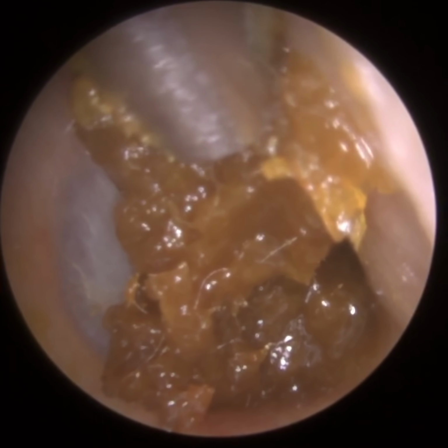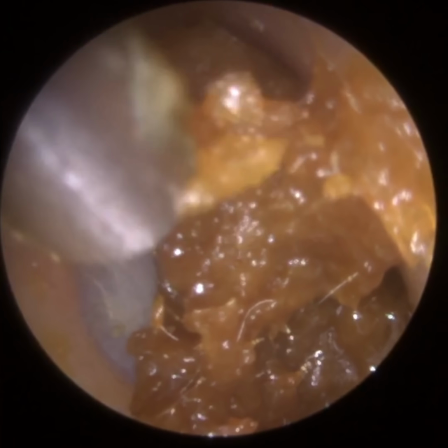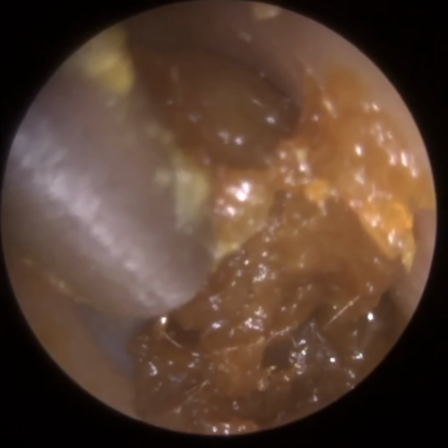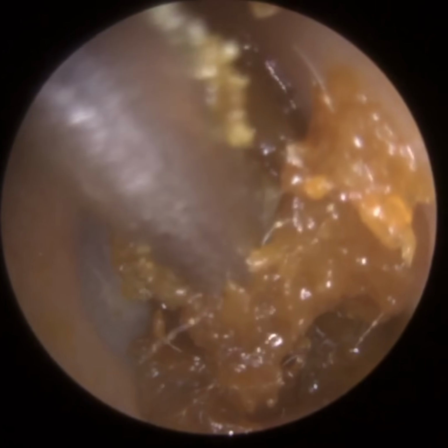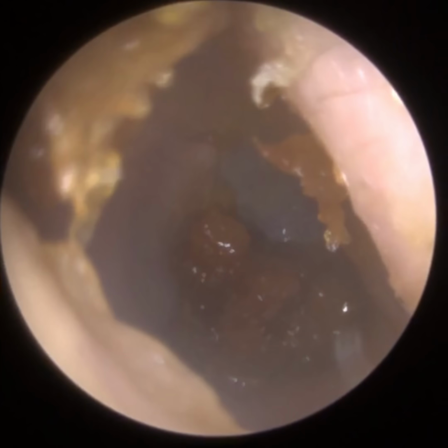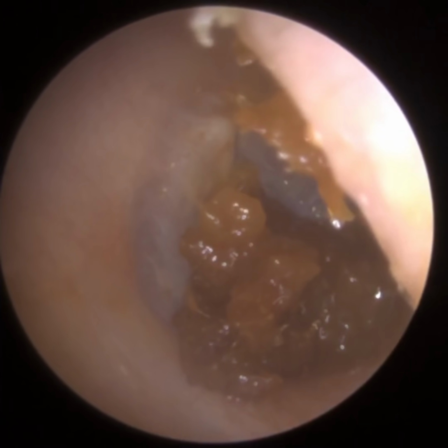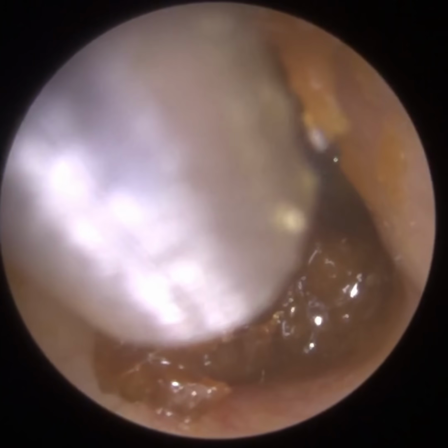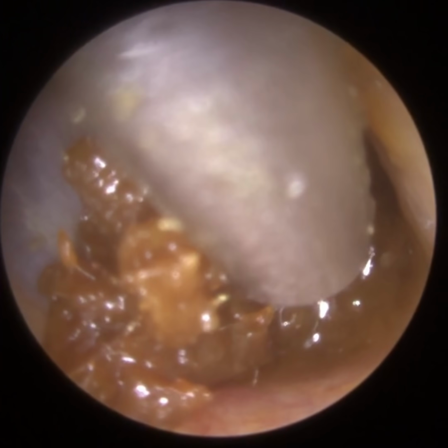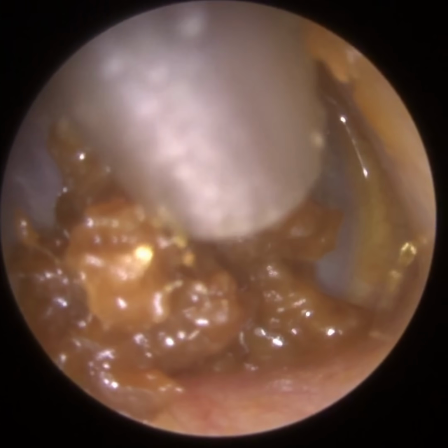So it's just some wax on the anterior canal wall, and this is why an endoscope is far superior in my view to any other visualization technique when viewing the ear to perform earwax removal. It's just because it gives you this wide panoramic view. You can see the whole ear canal and eardrum in one shot. So we can see the posterior, the anterior and the superior portions of the eardrum, which means we can see the back, the front and also the top part of the eardrum.